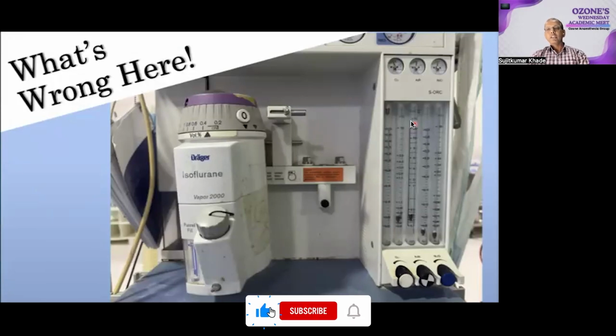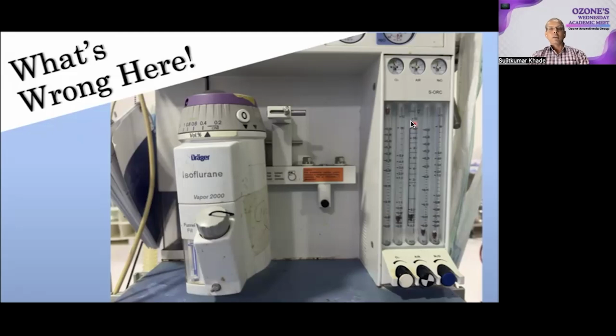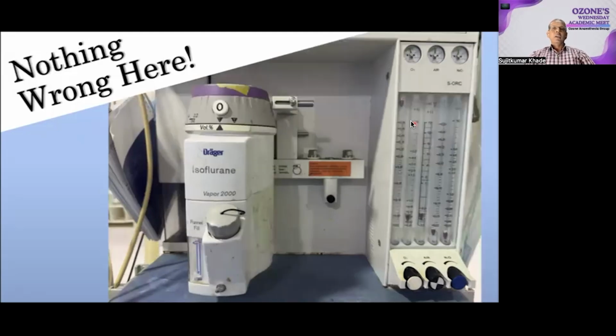Actually, this vaporizer is shifted from one OT to another wherever it is required. Somebody fixed it on the Dräger machine, but it was not fixed properly. And isoflurane was not delivered to the breathing circuit at all, leading to complete intraoperative awareness. Here the vaporizer is fixed properly, but I guess it was too late.